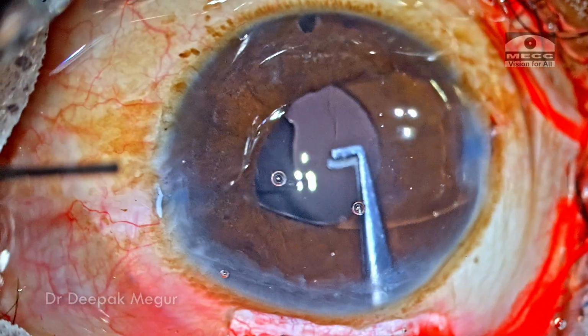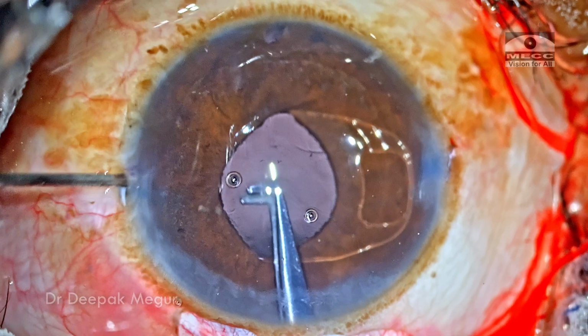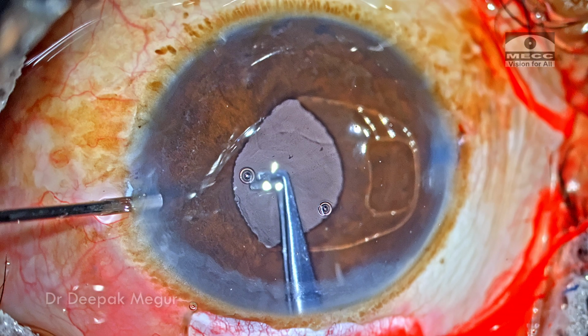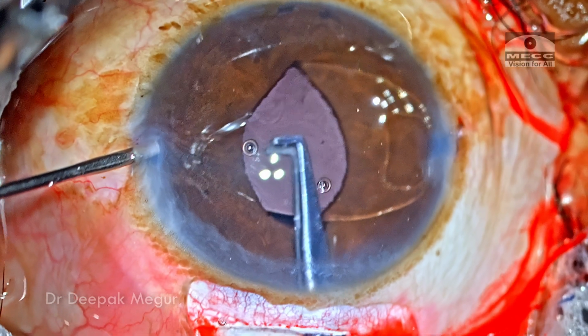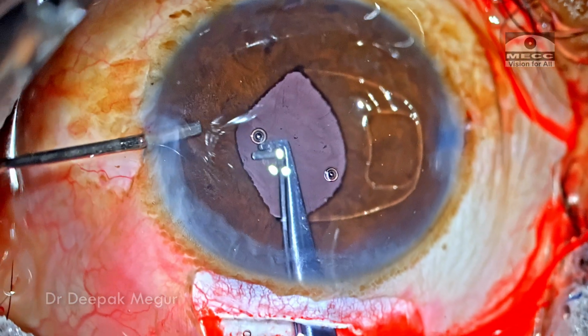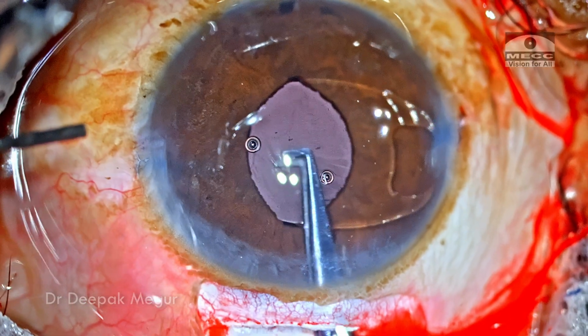So the first haptic now goes under the iris, and I'm going to use a 26G cannula, which is the one which I use for hydrodissection, to enclavate the iris into the lens. So I just nudge the iris with the cannula, and I can see a small dimple appearing in the surface of the iris. A second nudge is done to ensure that a larger amount of iris tissue gets enclaved.